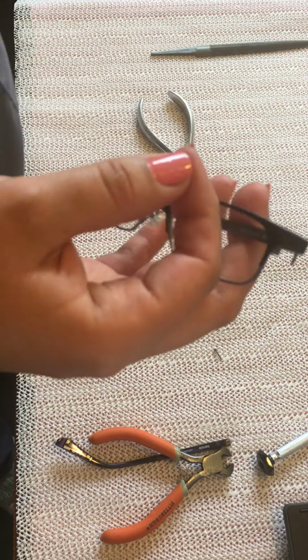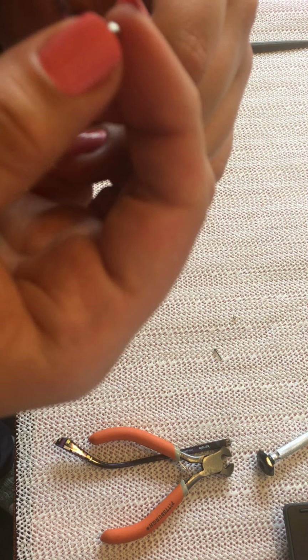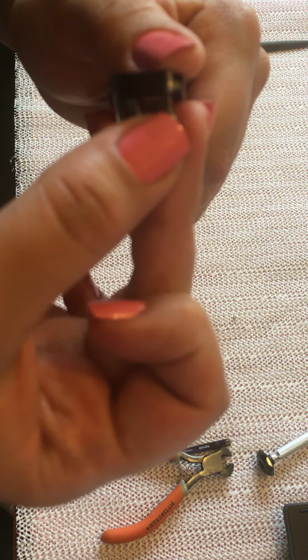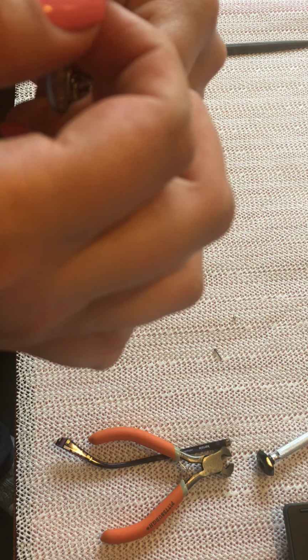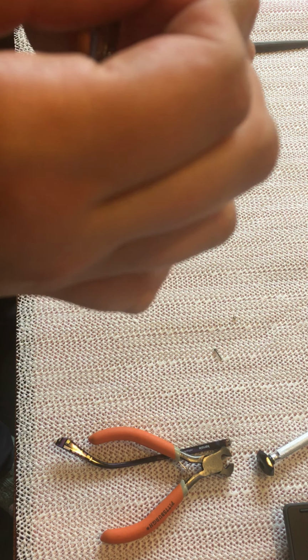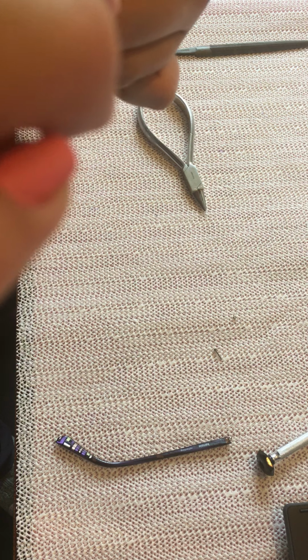Okay, I had to remove the bolt to see which method is easier to put it back in. So again, the flat side facing the frame and the curvy side. I don't know why it doesn't want to.